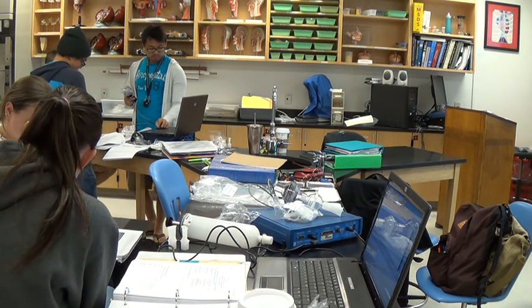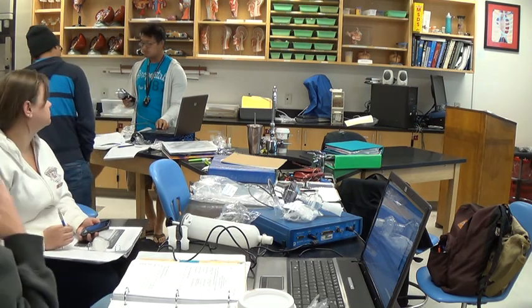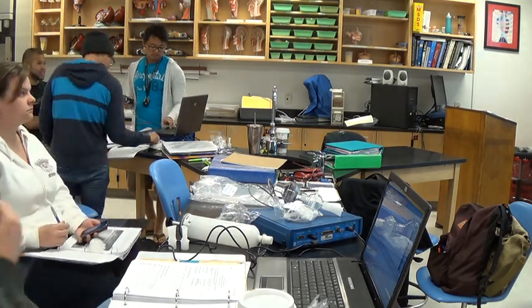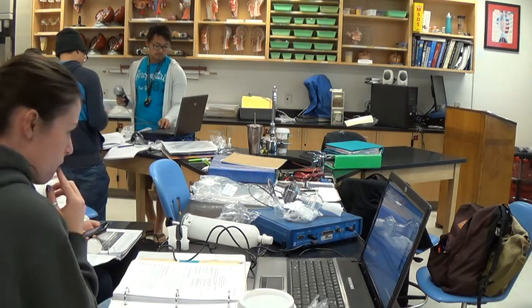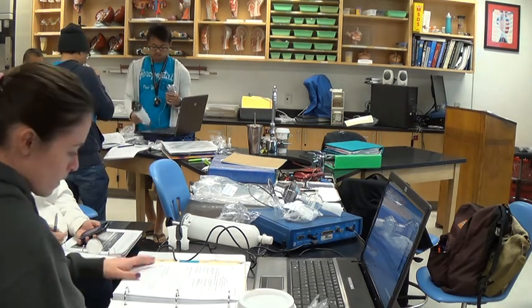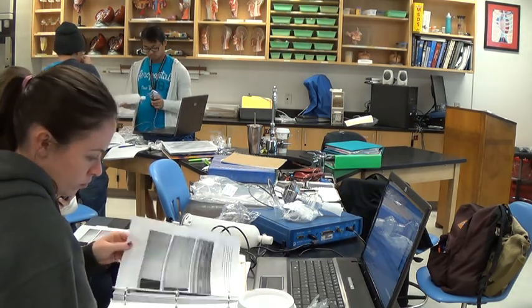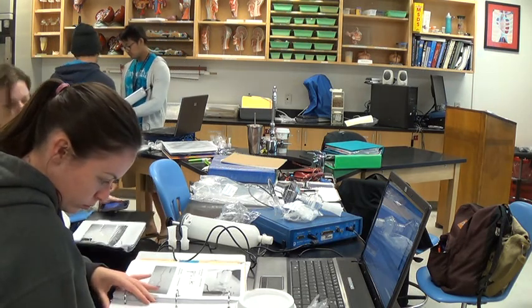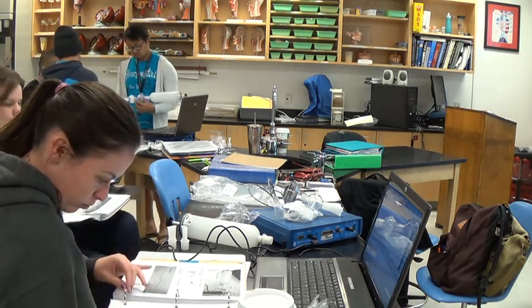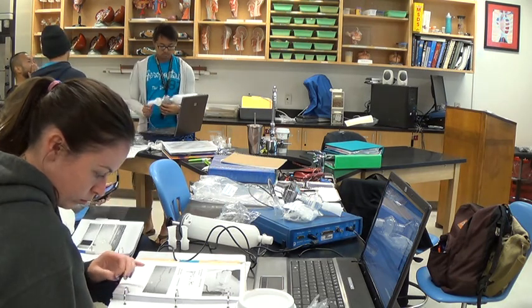Is this the end of our strip? No, I did. You did twice. You breathed in deep twice, so it doesn't matter which one we look at. You did a super deep breath and then exhaled. Well, you should look at this one because this is the airflow. So the maximum exhalation, standing on one leg, and then maximum. It's just wherever. So on here they got me a peak.